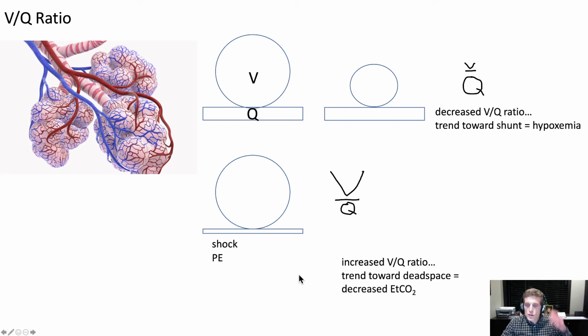Okay, so you can see why patients with unstable hemodynamics, patients who are in shock, will have a falling end tidal CO2. And of course, the other side of this, the classic description is your cardiac arrest patient. We use end tidal CO2 for two things as a marker of good quality CPR. The higher the end tidal CO2, the more right ventricular output, and that's reflective of better chest compressions. And of course, when we get ROSC, we see that end tidal CO2 typically increase quite markedly. And again, that's because we have better cardiac output. So all we're talking about here is the reverse of that situation.